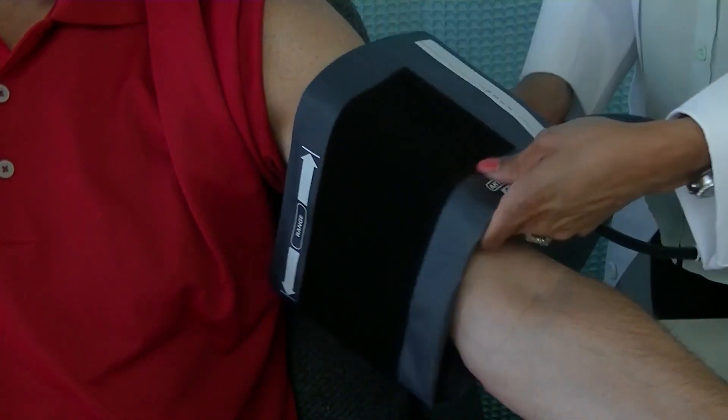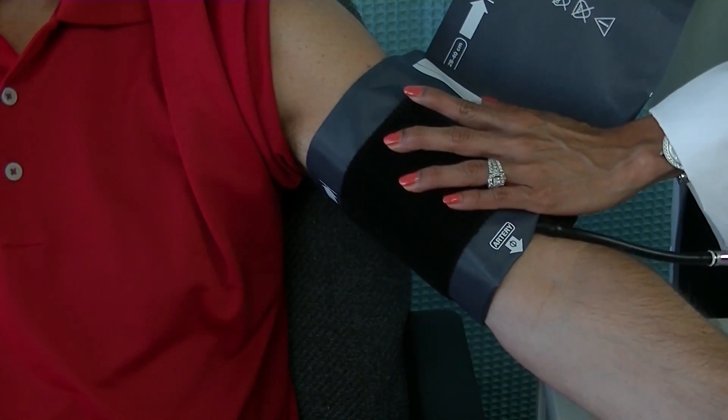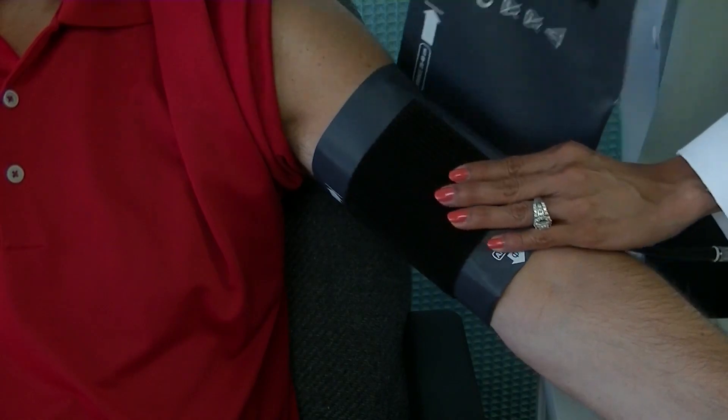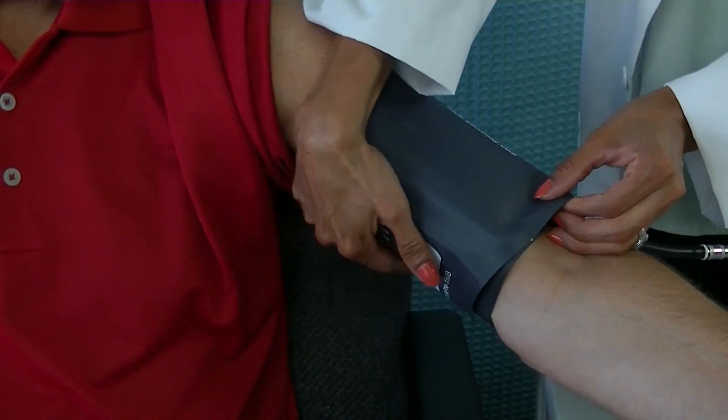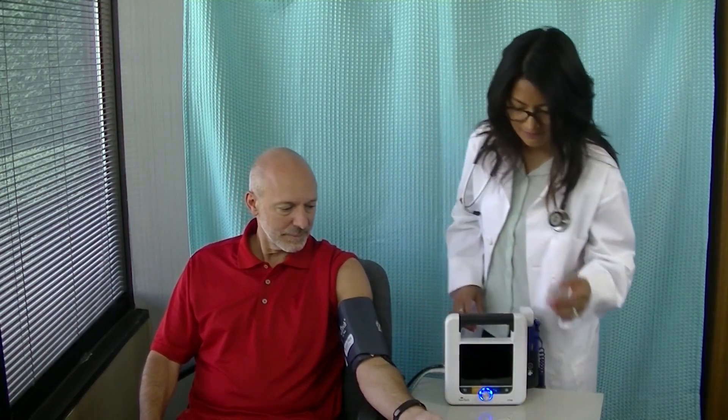When ready, place the cuff around the arm. The cuff index line should fall within the printed range markers. If not, select a larger or smaller cuff to ensure an accurate reading. Make sure the arm is relaxed and supported, and ask the patient to stay still and quiet. With the cuff in place, press the stop-start button and the cuff will begin inflating.